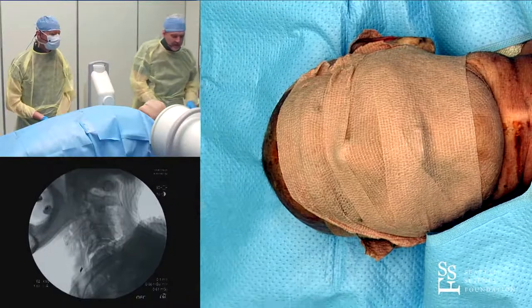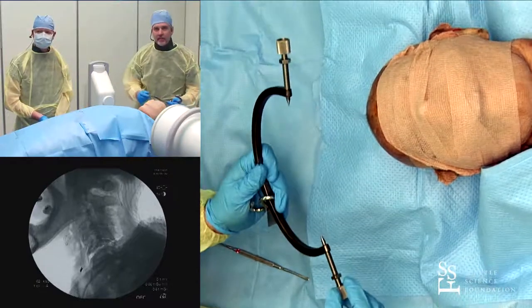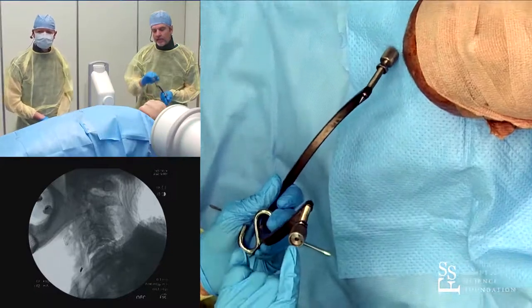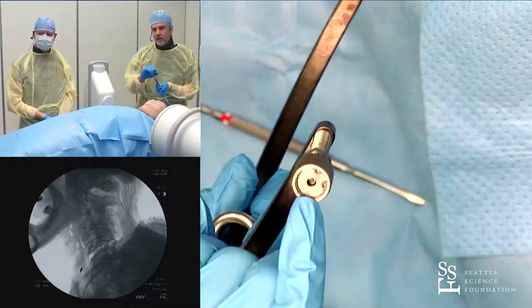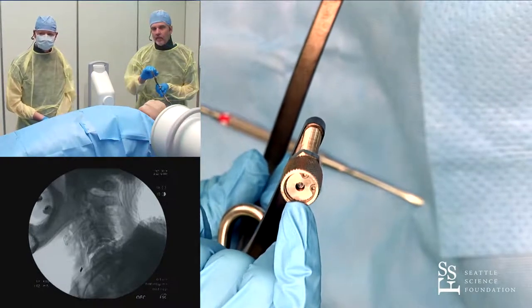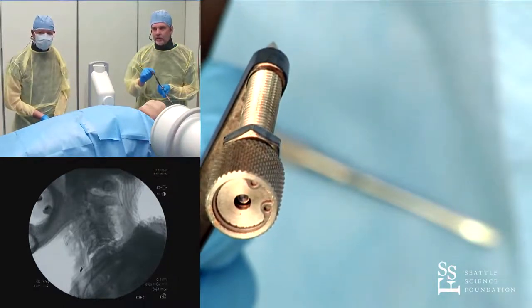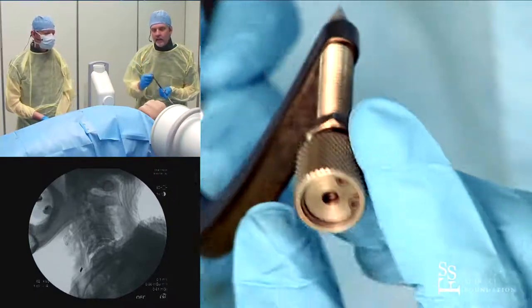Now for the tongs themselves: get the pin all the way out so you're not scraping across the scalp as you put them on, and make sure the internal nut is all the way out. When you tighten up, there's a small indicator pin — you can see it's recessed right now. That pin needs to pop out; that's how you know the tong is seated well enough. Go back within 12 to 24 hours to make sure the indicator pin is still popped out and everything is tightened down. Don't retighten after about 24 hours.